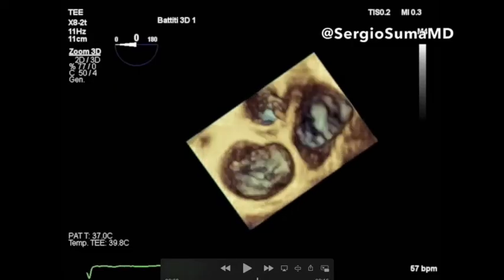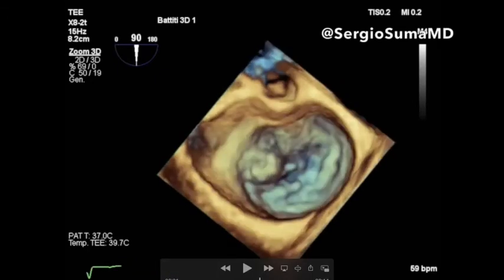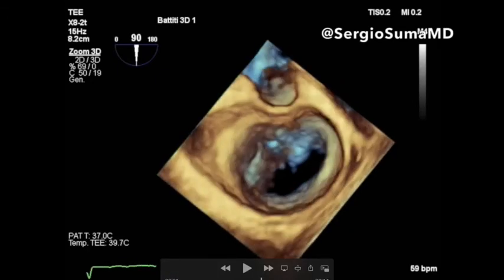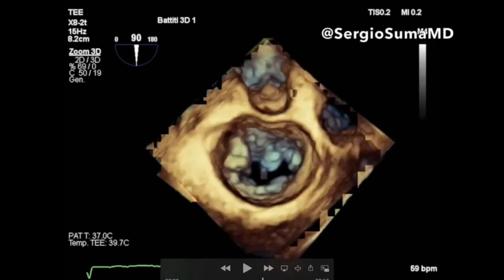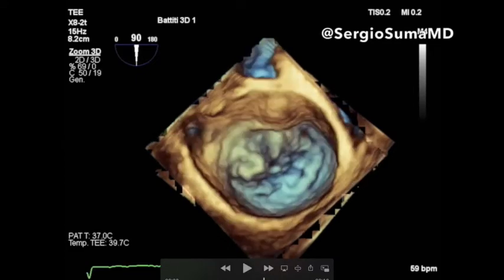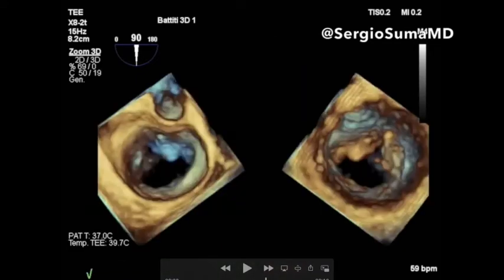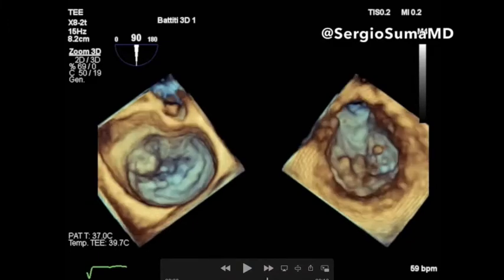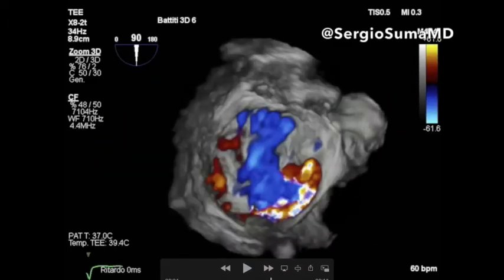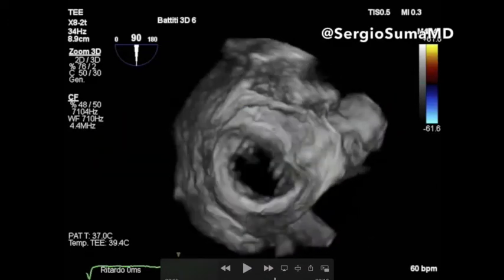As we can see at the 3D surgical view, there is a prolapse in the lateral commissural part of the valve, close to the left appendage, with an eccentric horizontal jet.